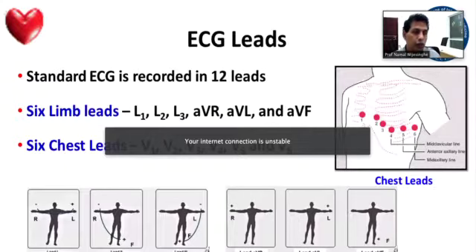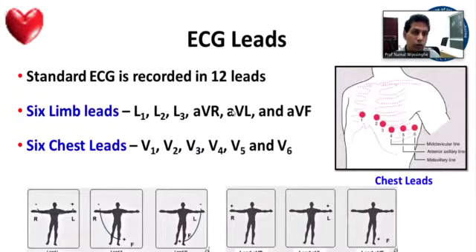So as you know, using the 4 limb leads, we generate 3 bipolar limb leads. Those are lead 1, L1, L2 and L3. We use 2 limb electrodes, get both electrical generations and combine them into one wave. And also we use unipolar leads, but we call them augmented limb leads, and then we generate AVR, AVL and AVF. So remember how you attach.